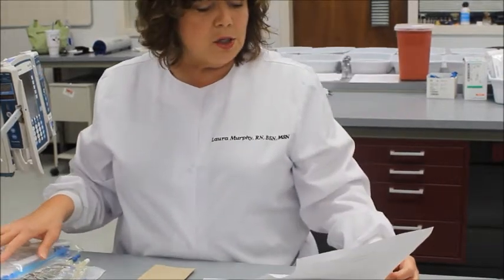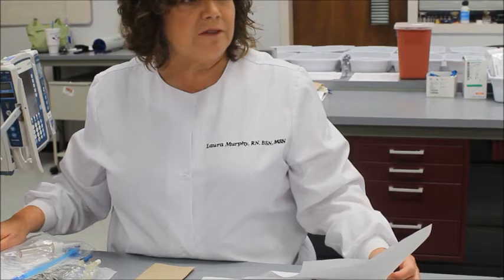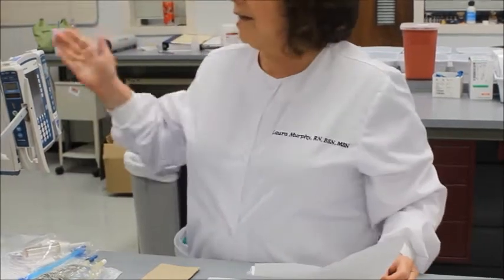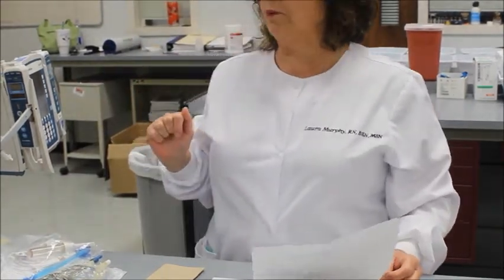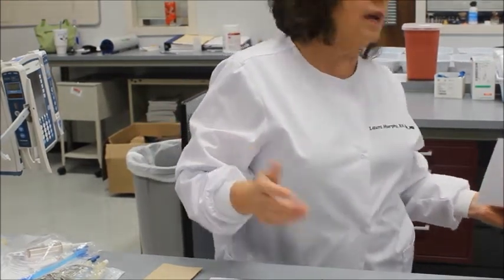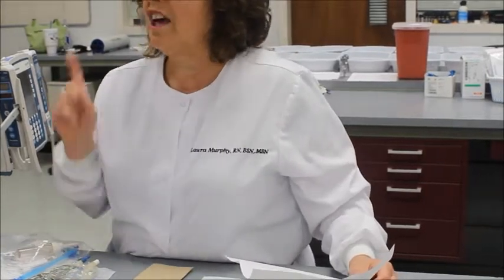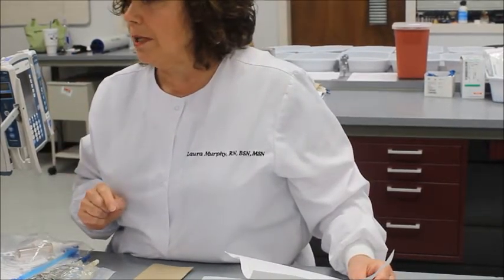The order reads start normal saline 500 at 115 an hour. I can't change that. I can't say, oh, well, I only want to run it at 114. Or please let me run it at 116. The doctor ordered 115. I have to have a clinical reason not to run it at 115.